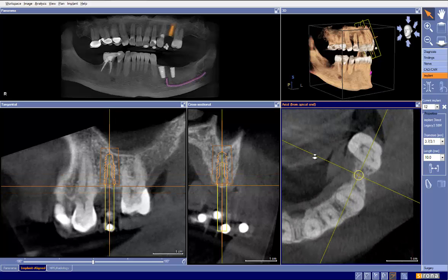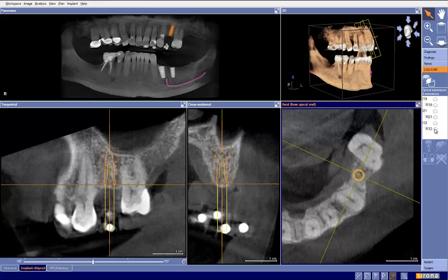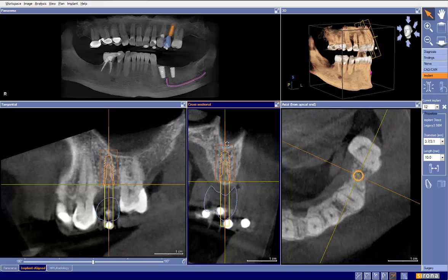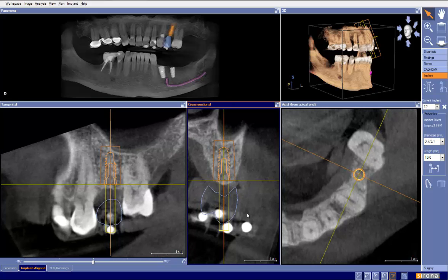What I would like to do here is to give you an idea of this implant was planned and placed based on the bone without the previous knowledge that we covered this weekend. So what I would like to do is bring in the CEREC data here, and let's take a look at the CEREC data. So now this plan was done. Now we brought in our CEREC data and take a look at where our implant is facing. It is actually coming out facial to the buccal cusp.